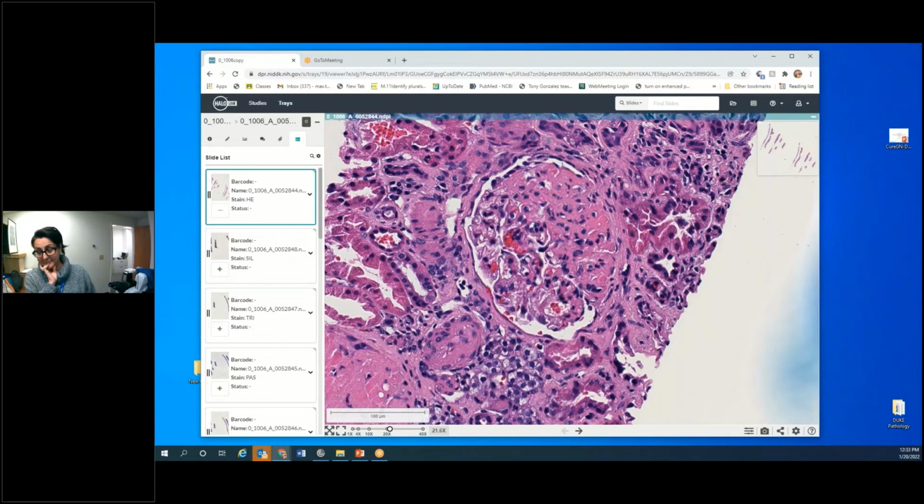Actually, I can email you the CRF and you can put it in there and then copy it over. There are lots of different ways to copy and paste, but the point is it doesn't put a mark on the whole slide image. It's virgin, so many people can use it for many different uses.